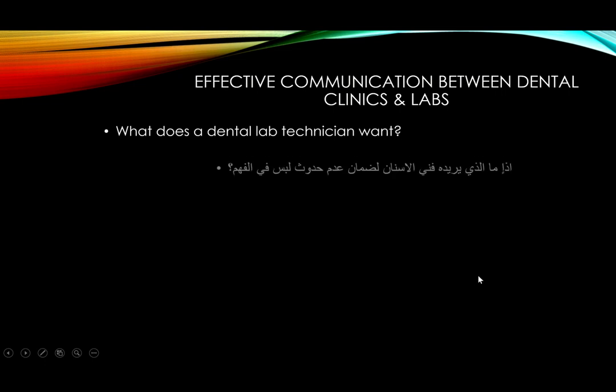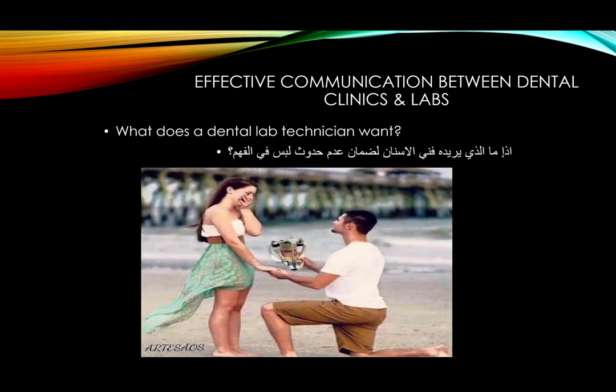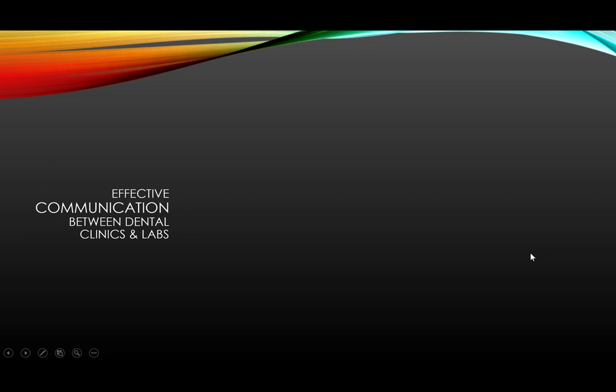Now, what does a dental lab technician want, really? To not fall into miscommunication, to not fall into understanding something that's not meant by the clinician. A semi-adjustable articulator, that's what a dental technician wants, to be happy.